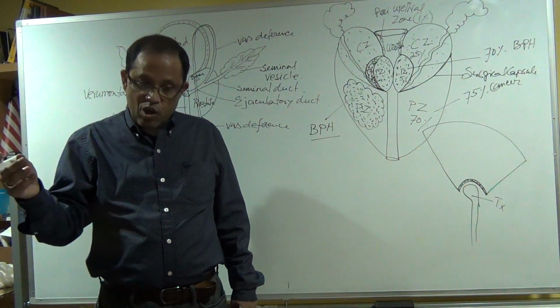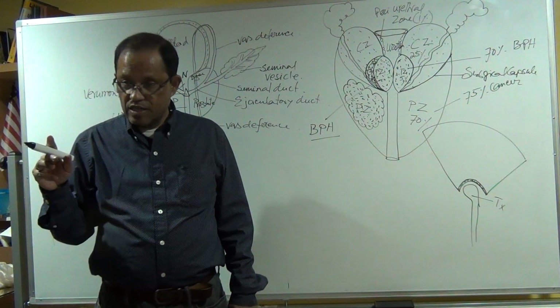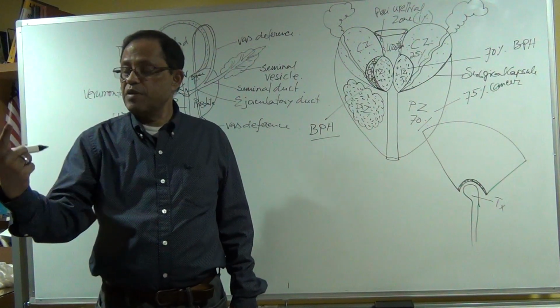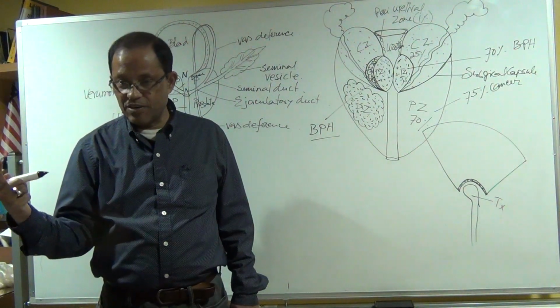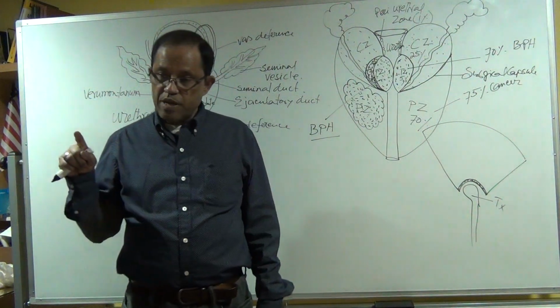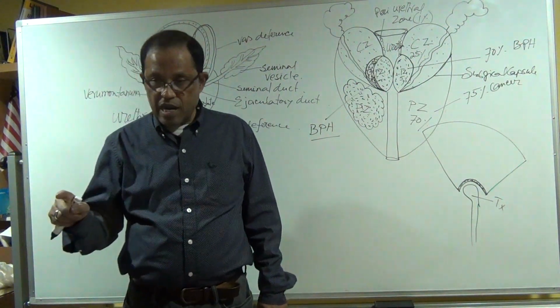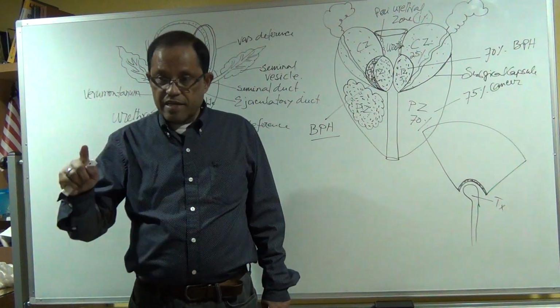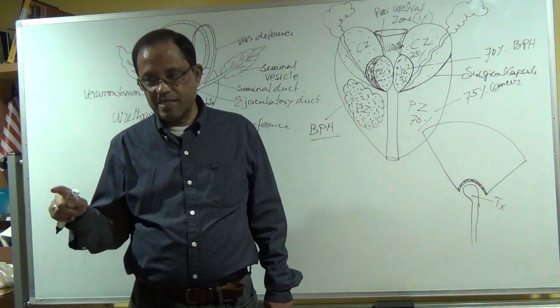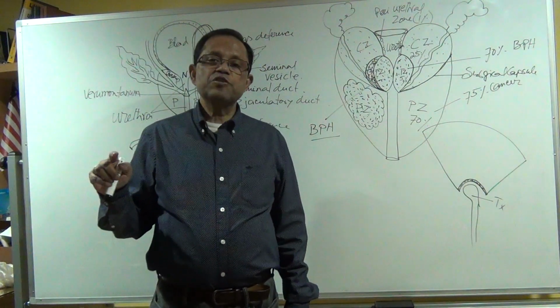If the wall of the rectum is invaded by the mass or not, they can pull out the finger and see whether there is any bleeding or not. That's why before rectal sonography for the prostate gland, digital rectal examination is a must. DRE, digital rectal examination, is a must.